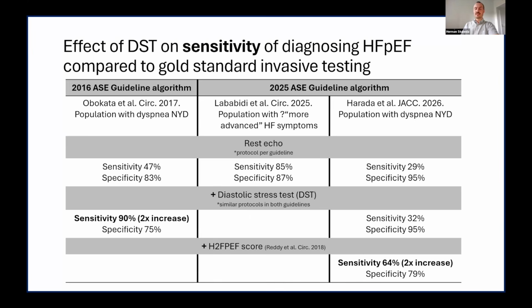To finish up, I'd like to highlight the evidence base for diastolic stress testing using studies that tested the protocol for the diagnosis of HFpEF in the real-world population when compared to gold standard invasive testing. In general, we want to add the diastolic stress test to a resting echo when we think the sensitivity for ruling out HFpEF is going to be a bit better.